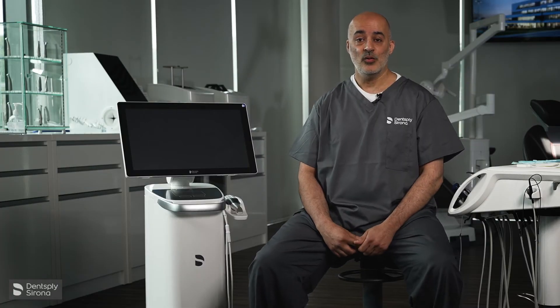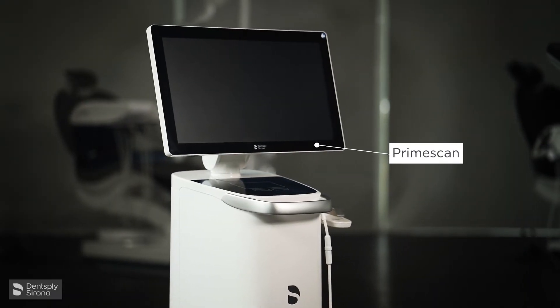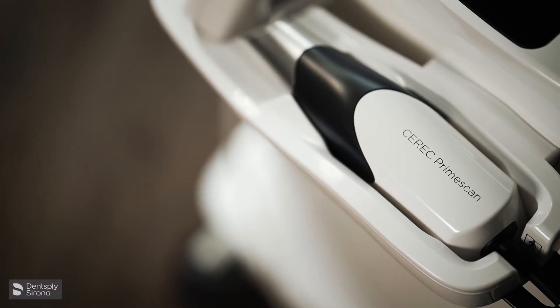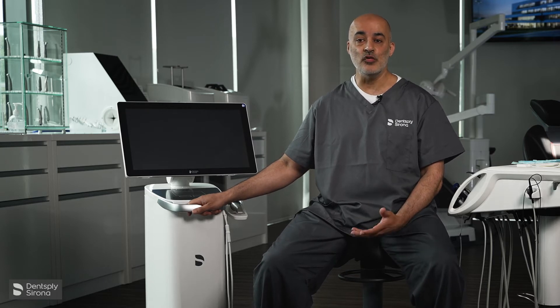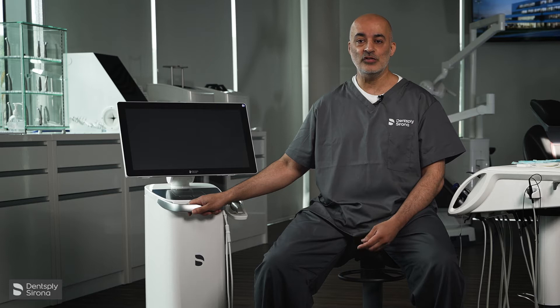Let's have a look at the Prime Scan. What do I really love about the Prime Scan? Well, it's aesthetically pleasing, it looks the part, it's hygienic, it's a medically approved device, and it's easy to clean in between patients. It's ergonomic so I can move from one surgery to the next without any problems at all. The trackpad and the screen are easy to use — it's intuitive.